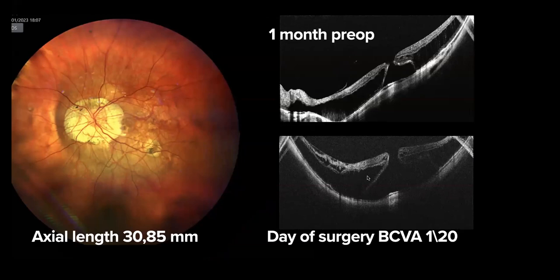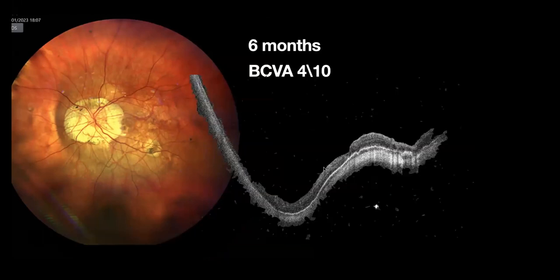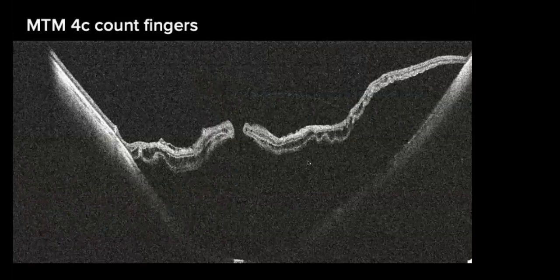This is a stage 3C. And this is after surgery. You see the macula is attached and she has a very significant improvement in vision. So my message to you is that this patient can have enormous visual benefit as long as the choroid is not atrophic in the macula.